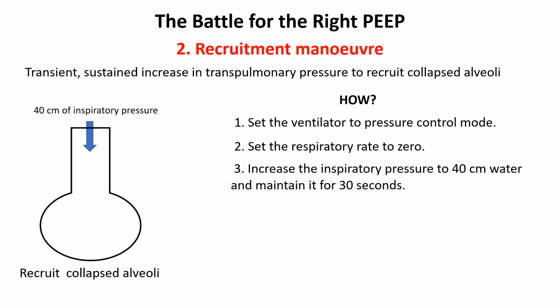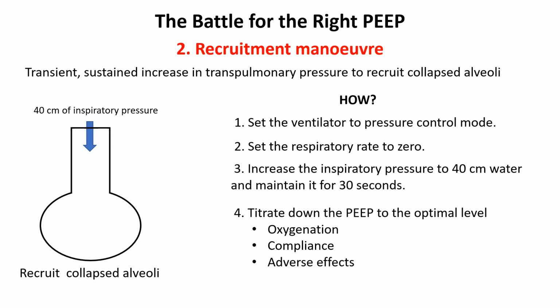After the maneuver, PEEP is adjusted stepwise, for example, from 25 cm water, while monitoring oxygenation, lung compliance, and adverse effects to determine the optimal level that maintains alveolar recruitment safely.